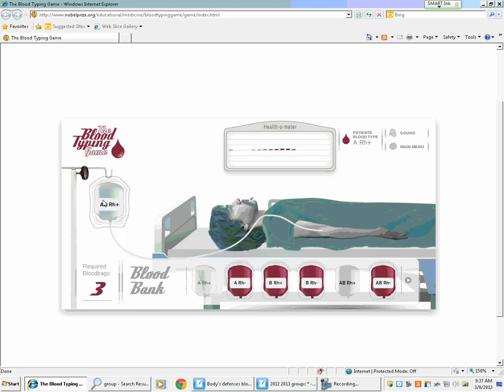Oh my God, doctor! You gave that patient AB positive blood. Why is the patient deteriorating? Raise your hand and tell me. Because it has a B what? Antigen. Does this person accept that B antigen? Why? Because he's type A and his body has what? B antibodies. What just happened?